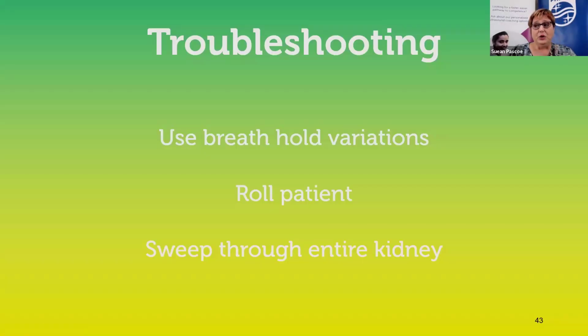And we'll get lastly to some troubleshooting. I think the biggest tip that I can pass on to you is to make sure you roll the patient on their side, and make sure you emphasize the breath in. For patients who have a solid beer belly, when you roll them on their side, they're quite square almost. They have really nice images of the kidneys because they have lovely perinephric fat around them. But sometimes you need to ask those people to push their tummy out. So it depends on their body habitus and how well they can breathe in.